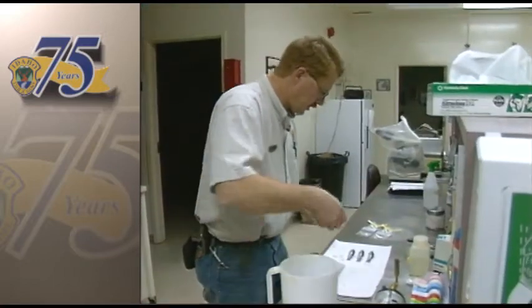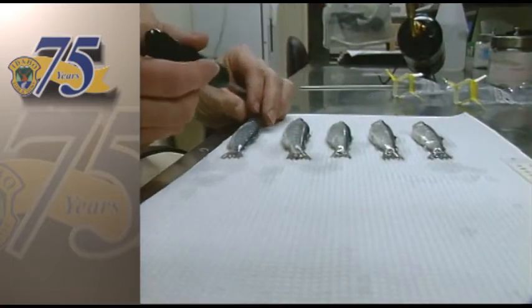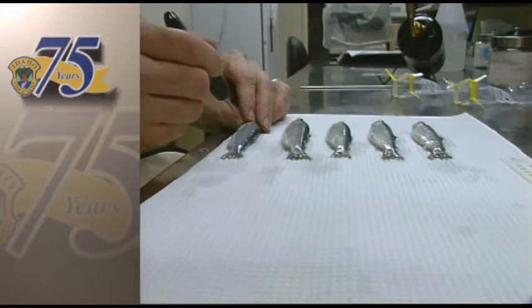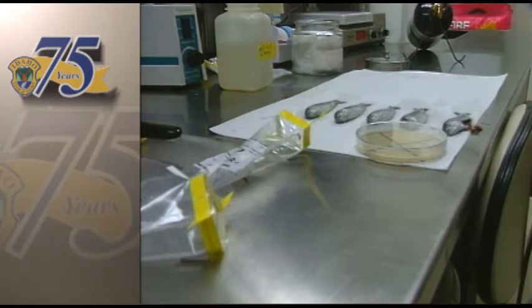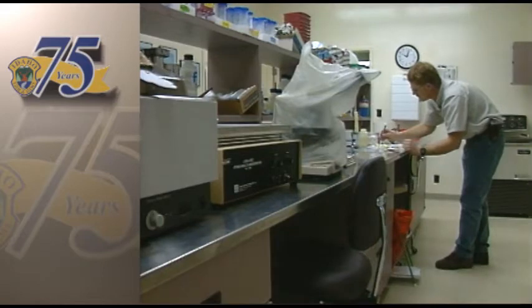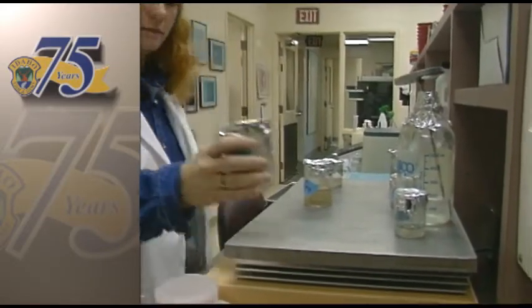Fisheries pathologist Doug Burton is running a research experiment on these small fish. He euthanizes them with anesthetic and then removes body parts, like the kidneys, to be tested for disease. We handle somewhere in the neighborhood of 600 cases a year here at the Eagle Lab. When a hatchery manager calls with a problem, the lab will perform a series of diagnostic tests on the ailing fish. But probably 2/3 of the tests done here are part of routine inspections.